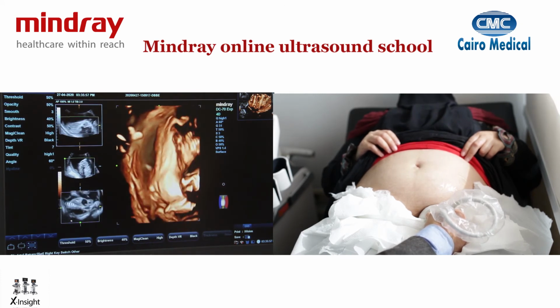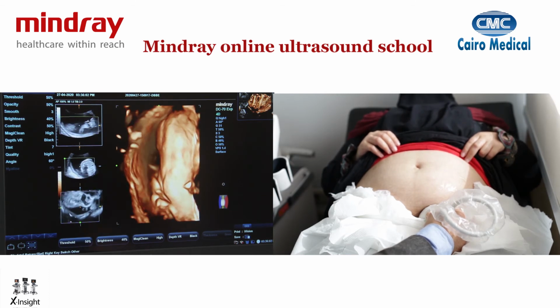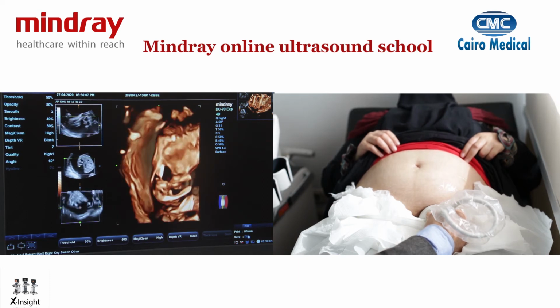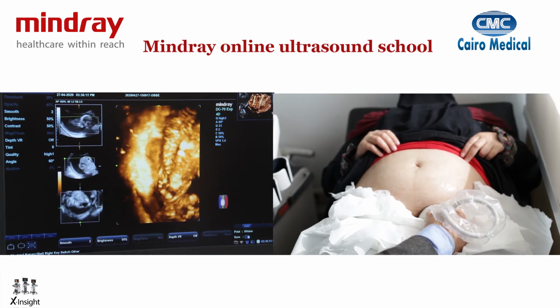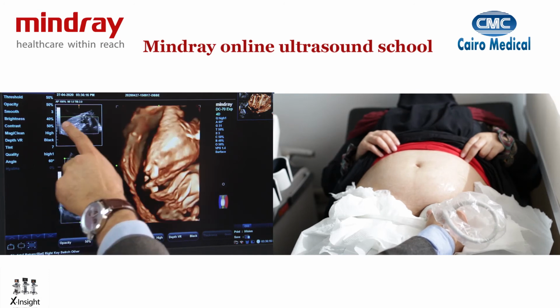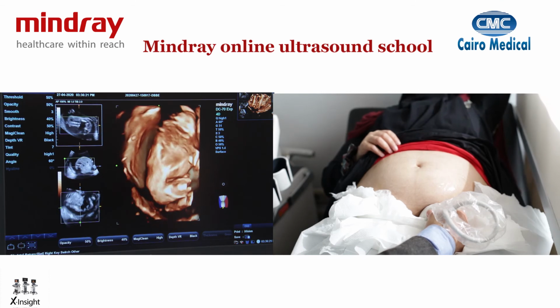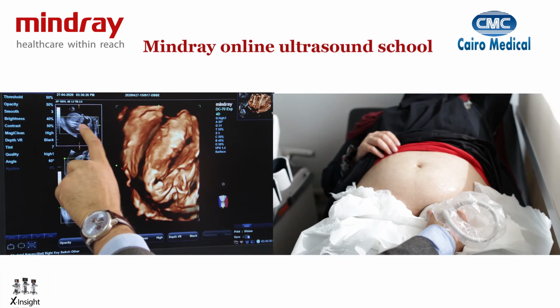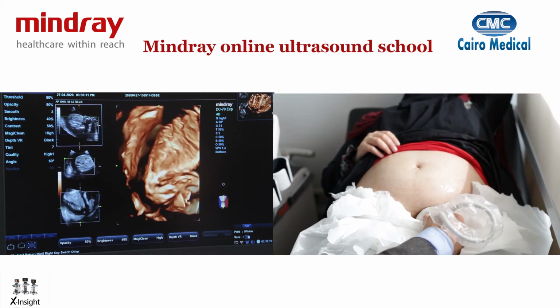Okay. With that, we can work with the different modes we have to check bones. We can go into a maximum mode where we can see the vertebrae, as you can see here. We can go to a surface mode where you can see the covering skin. Because the baby's spine is tilted in that image, I will rotate it so it corrects on your rendered image. So you can see my parallel line is parallel to the spine. I can come a bit closer or go further if I need to.